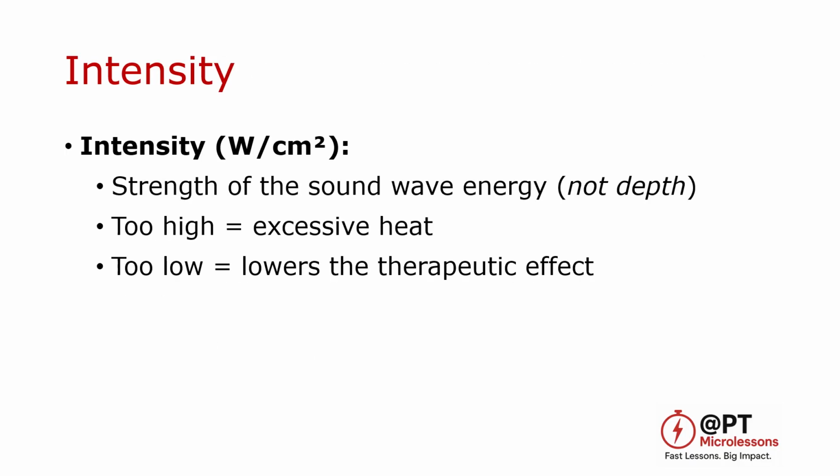Intensity refers to the strength of the sound wave energy, not the depth of penetration. If the intensity is too high, it may lead to excessive heating, while if it is too low, the therapeutic effect may be reduced. In clinical practice, intensity often needs to be adjusted based on patient comfort, especially in more sensitive areas. However, when intensity is reduced, less energy is delivered into the tissues, which can decrease the overall treatment effect. As you will see, when energy delivery is reduced, treatment time often needs to increase to compensate. So while patient comfort is always a priority, adjustments to intensity should be paired with adjustments to time to ensure an effective dose is still delivered.